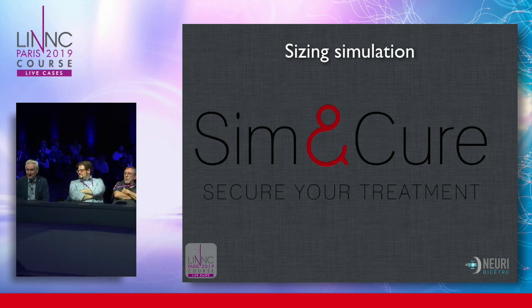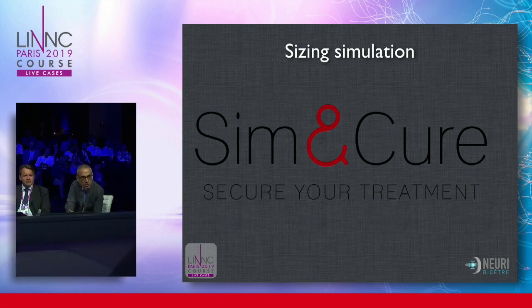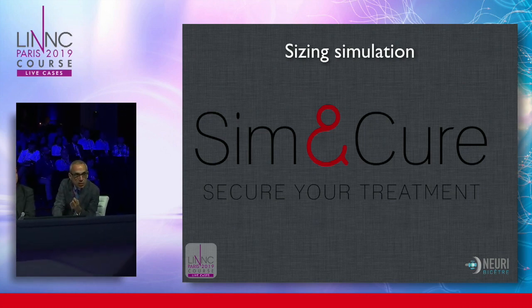Is somebody foreseeing a future for this flow study? Even Fadi Charbel, who is the king of the flow study, is not too optimistic. No, I think that for occlusion of the aneurysm, you're right. You're absolutely right. If it doesn't work, you can put another one. Where I think it might be of interest, but the problem has already been stated, is the concern of compromise of branching points. Can we reliably simulate that? Or downstream effect of flow.